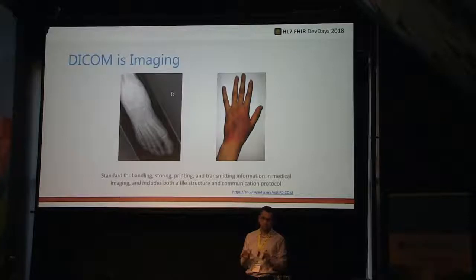Again, DICOM is imaging. Any image should be, in theory, captured within DICOM, whether it's your typical X-ray or if it's your rash or something else.